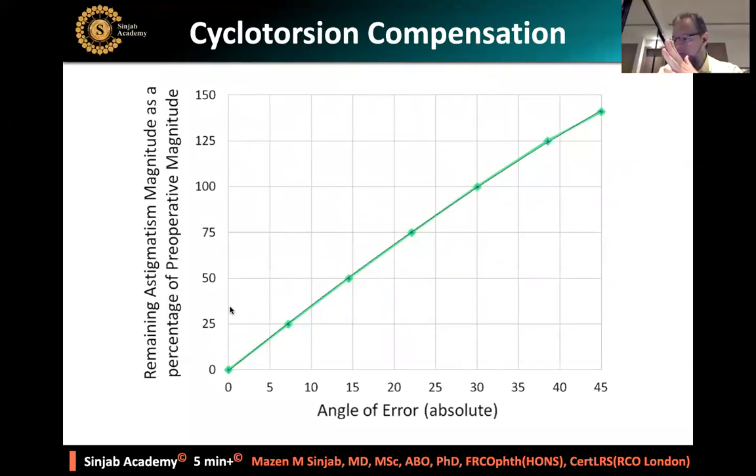Yes. Any comment until now? Yes, actually, I will take the last point that you have added, and this is very crucial, Dr. Mazen. Thank you for writing this. It's not inducing just a normal astigmatism, as you mentioned, it is not a regular astigmatism. Actually, it's a secondary astigmatism, one of the higher order aberrations, because you are creating a new pattern.